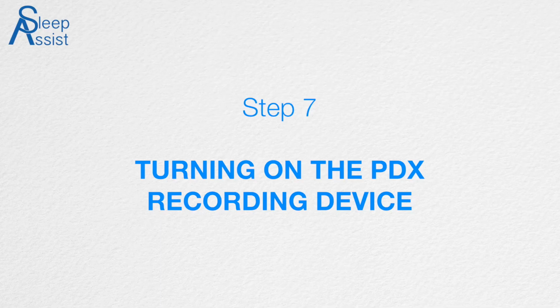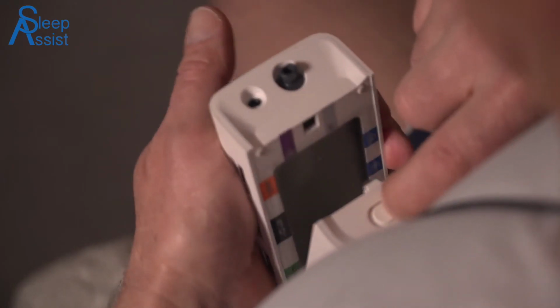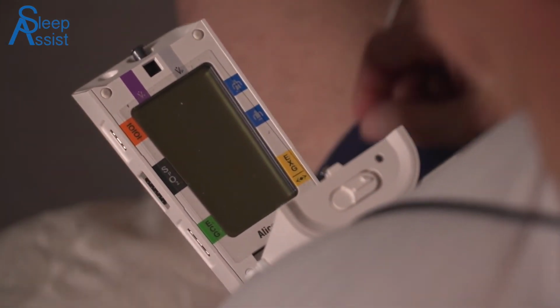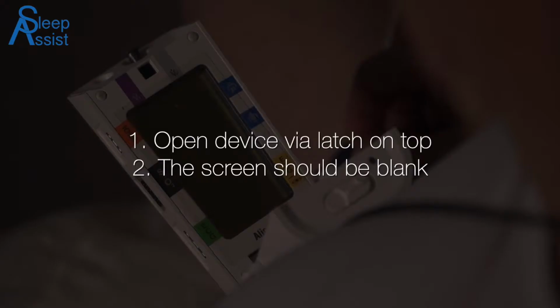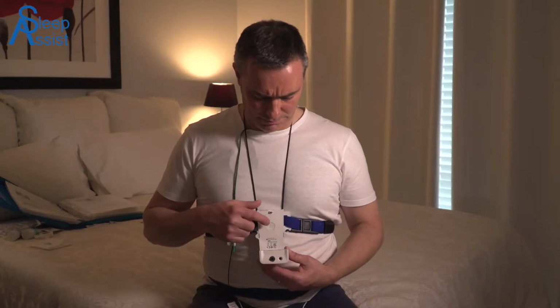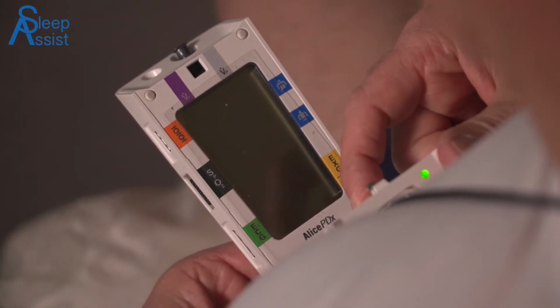Step 7. Turning the PDX recording device on. Open recording device via the latch at the top, sliding it in the direction shown on the latch. You will now be looking at a blank screen. Press and hold the power button for 2 seconds. A green light will illuminate at the top of the device.